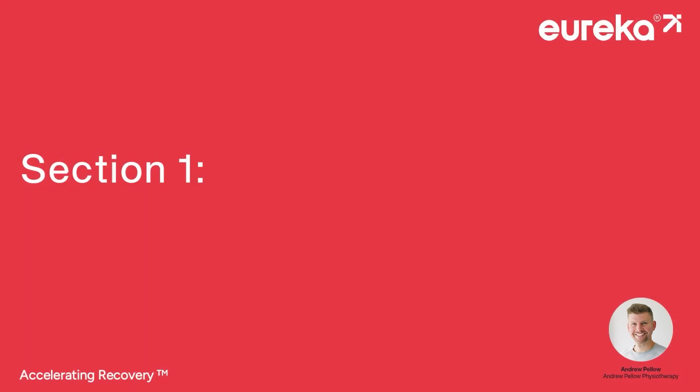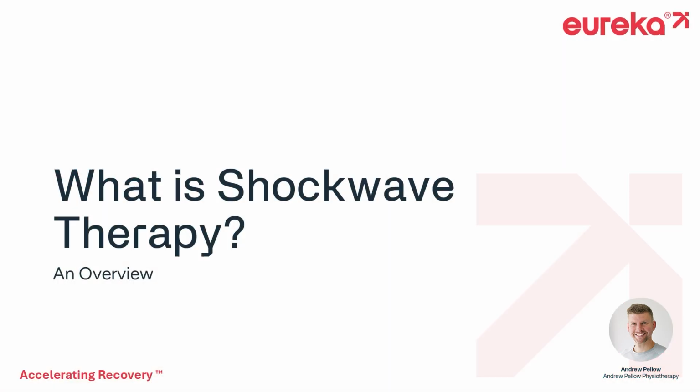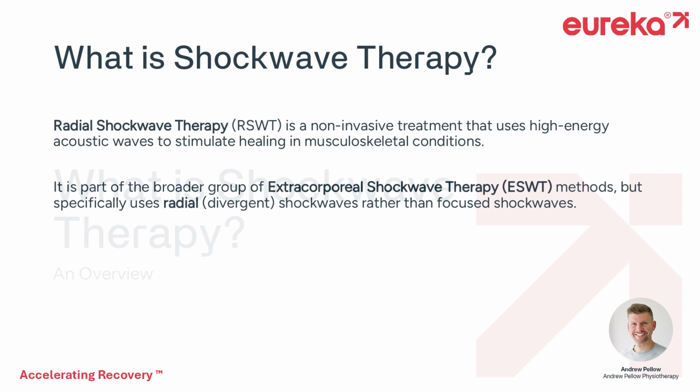Section 1, an introduction to shockwave therapy. What is shockwave therapy? An overview. Radial shockwave therapy is a non-invasive treatment that uses high-energy acoustic waves to stimulate healing in musculoskeletal conditions. It is part of the broader group of extracorporeal shockwave therapy methods, but specifically uses radial shockwaves rather than focused shockwaves.